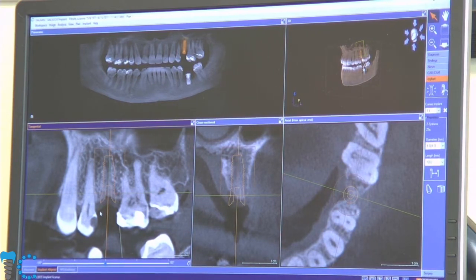Implant dentistry is a restorative specialty with a surgical component to it, and we're planning the restoration that we want, and then we're working our way backwards to support that ideal restoration. In this case, a 4 millimeter diameter implant is clear, and we could use an 8 or a 10 millimeter implant. If we really wanted to get a little tricky, we could use a 12 millimeter implant.